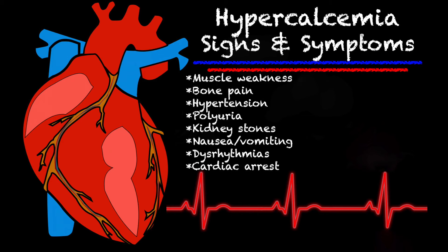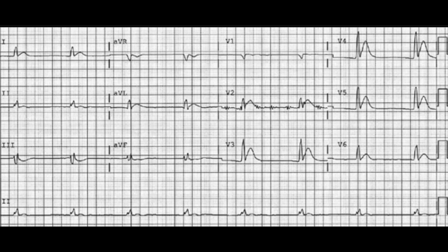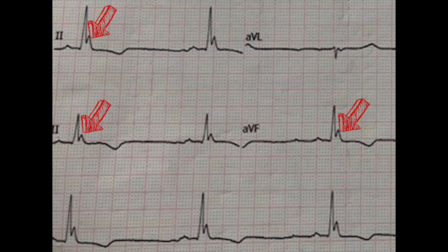Let's take a look at hypercalcemia on a strip. You can see that the QT interval is definitely shortened — you can see it in V1 through V6, they are pretty obvious. And if you look closely, it looks like the P waves have pretty much disappeared, so this is probably a pretty severe case of hypercalcemia. Where the arrows are pointing, those are what we call Osborne waves. They're typically associated with hypothermia, but in extreme cases they are associated with hypercalcemia as well.